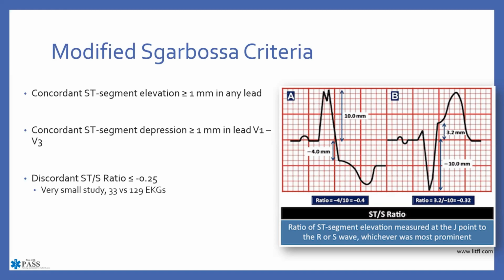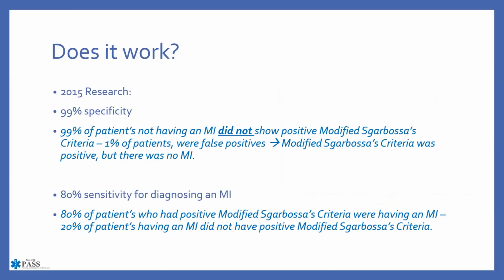And then there's a pretty small study that was done where they looked at some of this, and this is where this modified Sgarbossa criteria has come from. As I've already mentioned, it's kind of gee whiz knowledge, and it's nice to know if you're an EKG guru or you really are interested in reading about this stuff. I just wanted to put this on your radar that the information is there. And people do use it. They may use it in the ED and certainly in cardiology, but there is a possibility to read through your EKG.